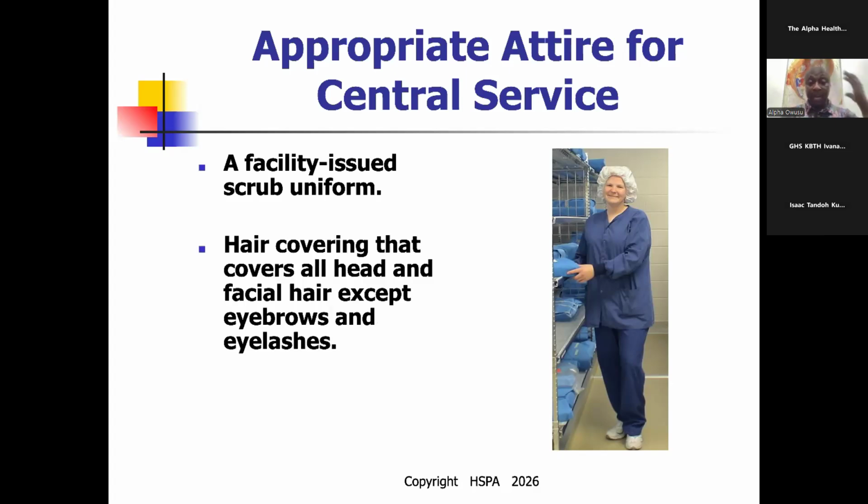Uniforms, hair cover, right? And when you are covering your hair, everything should be covered. Your ears should be covered because there has been an event related where we have infection from our ears, right? That infects the instrument, and then you have to wear long overcoats, right? That will cover all your hands. I have seen trays that have hair in the tray, cuticles, a lot of things in the tray, chewing gums in the trays, and so we have to dress properly. Very, very important.